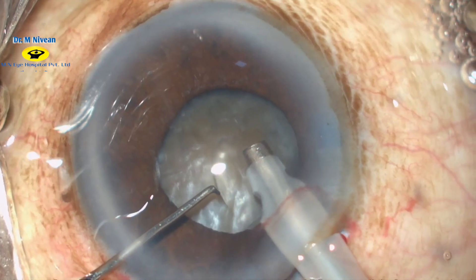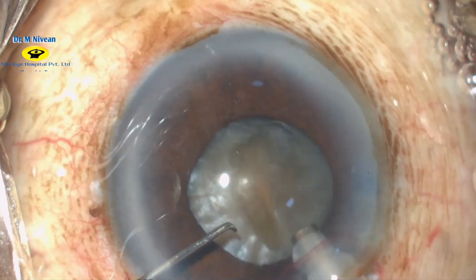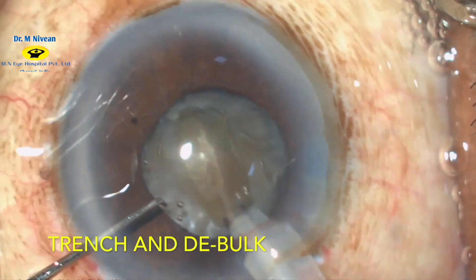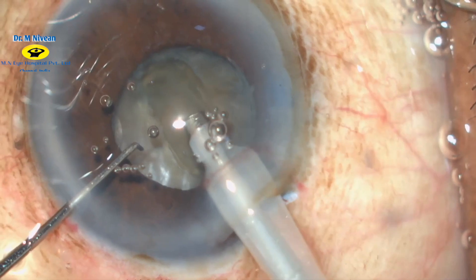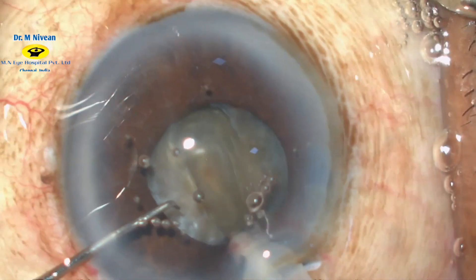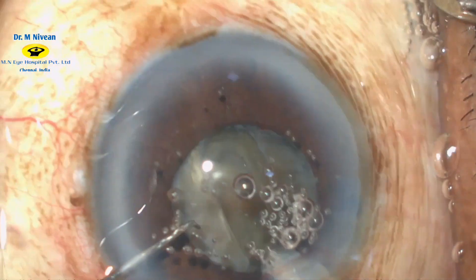Phacoemulsification is commenced in phaco 1 mode with the trenching and debulking of the nucleus. Slightly higher power is utilized to make sure that there is no force exerted on the nucleus. The width of the trench should be one and a half times the thickness of the phaco probe.